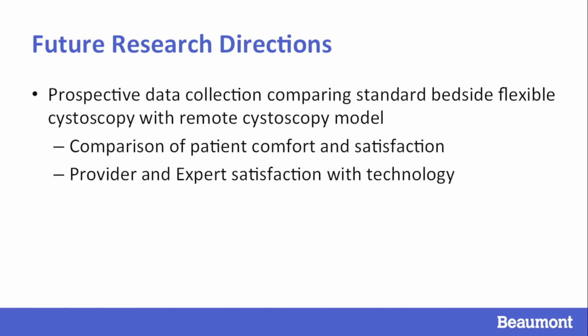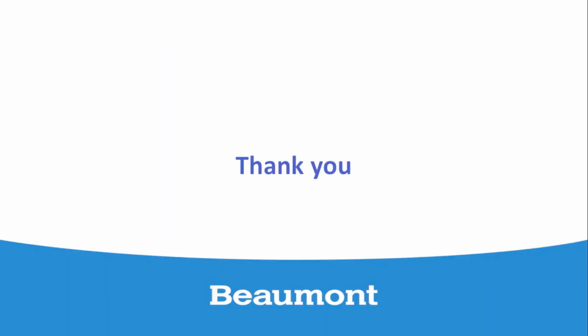Next steps for study of remote cystoscopy will include prospective data collection comparing standard bedside flexible cystoscopy to remote cystoscopy model to demonstrate non-inferiority. Thank you.